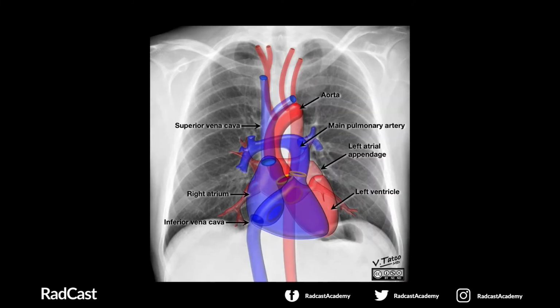On this diagram, here we have a colored representation of the heart and major vessels that can be assessed in the chest X-ray. Again, this shows the utility of the chest X-ray in evaluating these major vessels and the heart, and can really help us determine certain pathologies and lead us to investigate further if we see any abnormal pathology. For example, if we see abnormalities with the aorta, we may want to investigate this further with special scans of the aorta to further visualize it in detail.